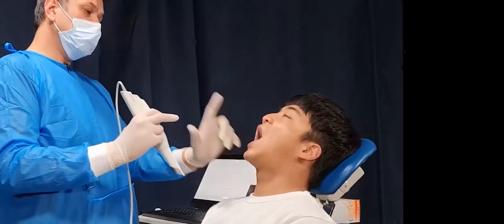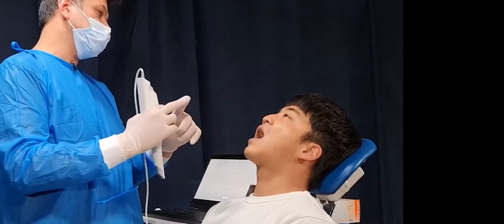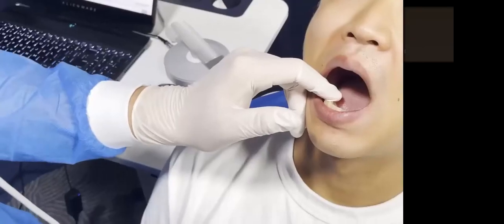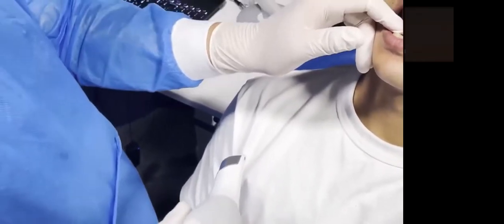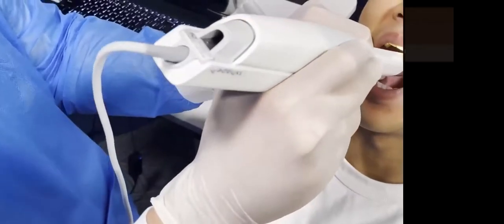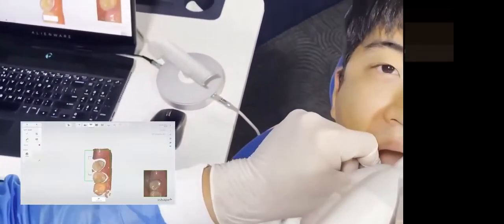Now, you'll notice my index finger. And again, look for my index finger when I'm scanning, because that's my support finger. My support finger is actually on the lower occlusal surfaces of quadrant 4 to support my thumb, even though I'm working up in the, so we're actually going to be working with a back molar, so it's a 6. So we're going to be working with a 2-6 today. The spaces are 2-6. And I'm using my thumb now. So let's have a look here.